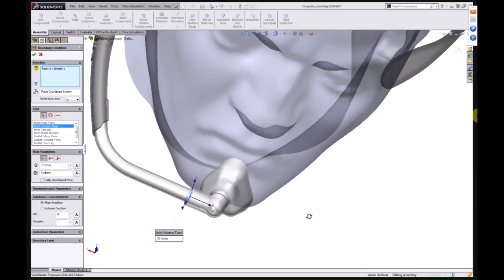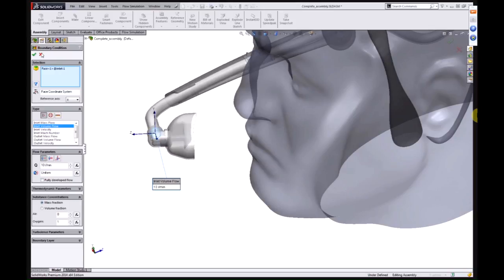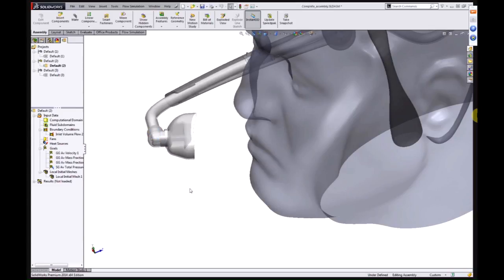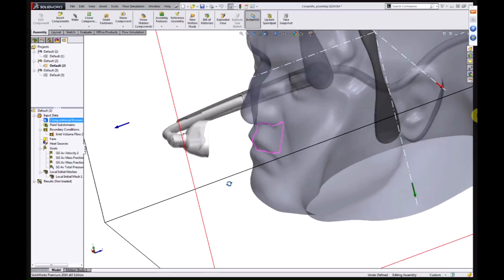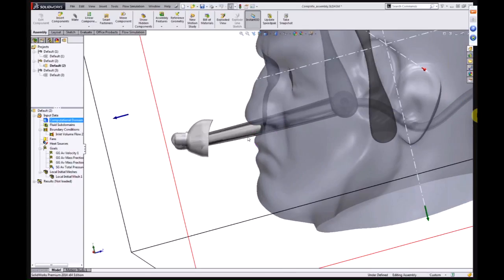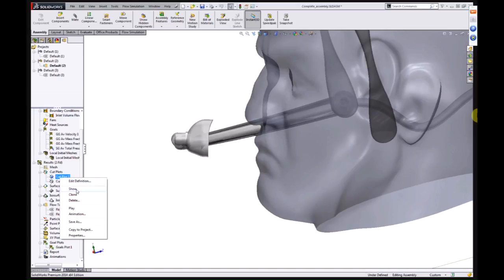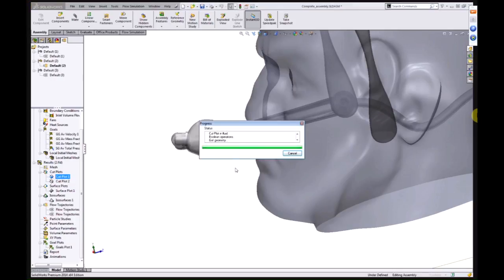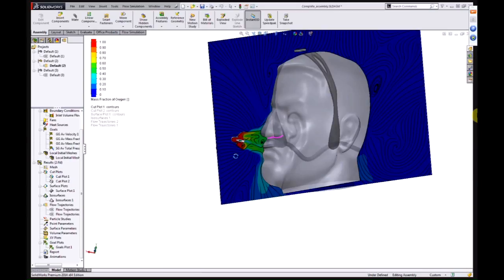And we go off and run that, and it's going to analyze both the fluid patterns and the concentration of the fluid as it gets through. There's a variety of ways we can interrogate that. One of the simplest is to take a slice through the model at a particular plane and look at certain properties. We could look at the oxygen concentration. We can use the probe tool to pull off a numeric value of what that concentration is at the nose and mouth. It looks like it's around 50% right now.